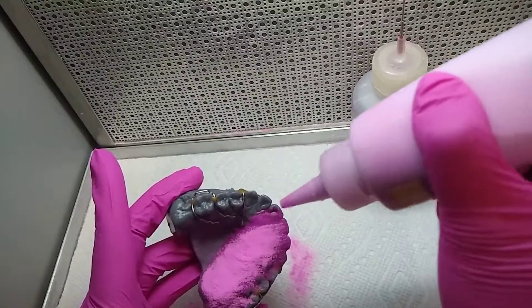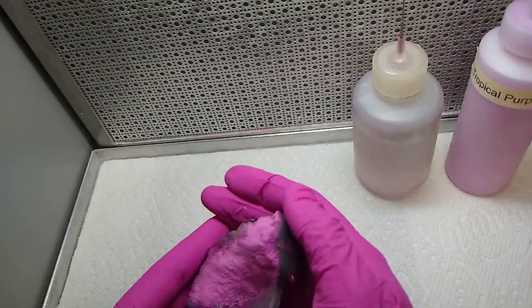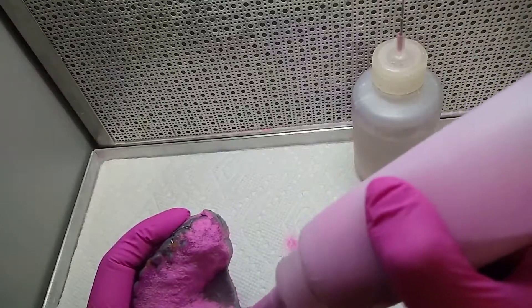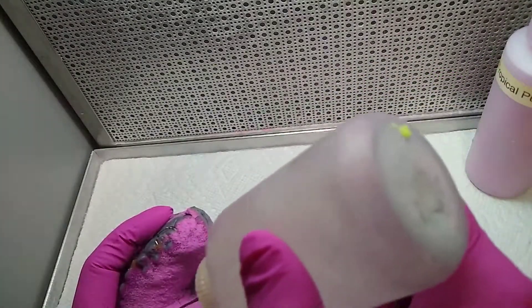Once you finish one half, do the other side. I usually cover all the teeth.